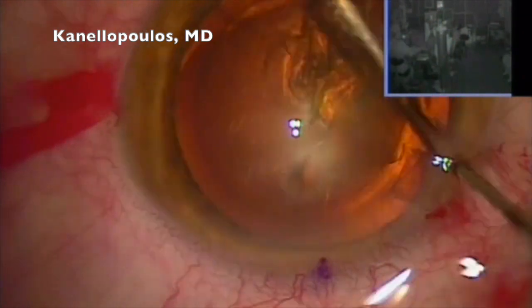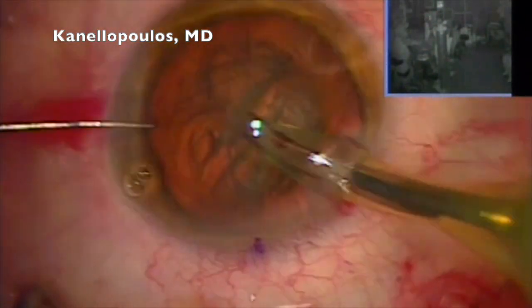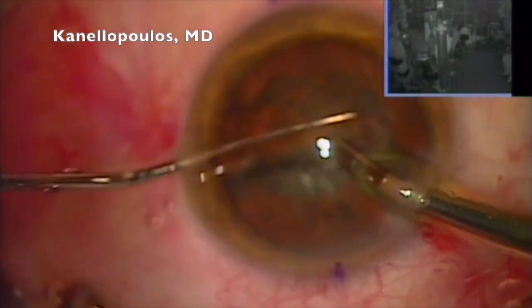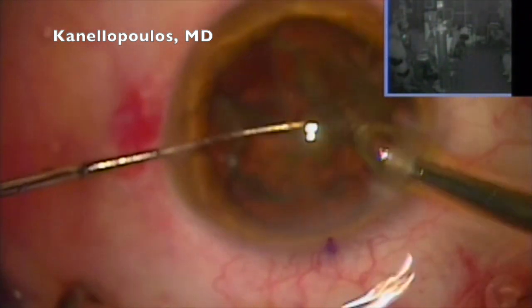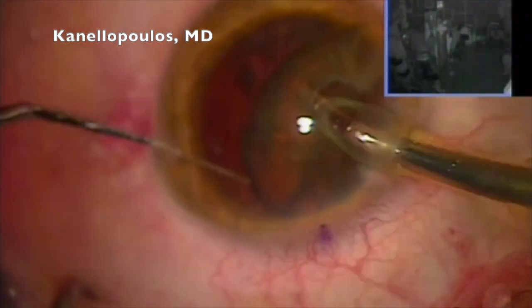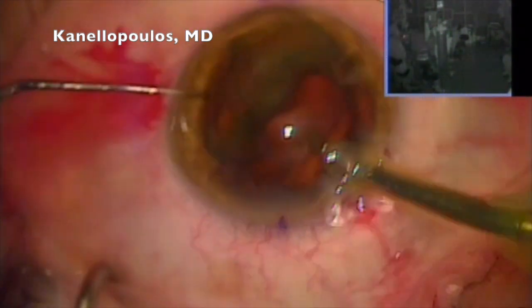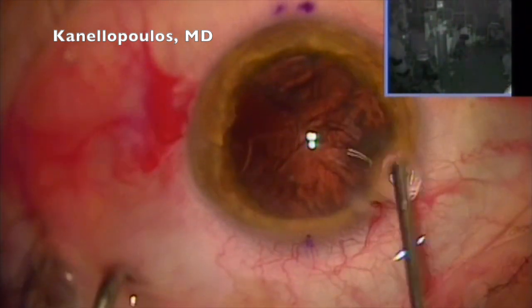Nothing really remarkable here. This patient I had performed hyperopic LASIK close to 20 years ago for about +2, so difficulty with the formula. We're going to divide and conquer, and all procedures today are speeded up ×8. I apologize for the speed, but it's mainly to make them easier for people who are not familiar with eye surgery to watch, but also get the basic principles.